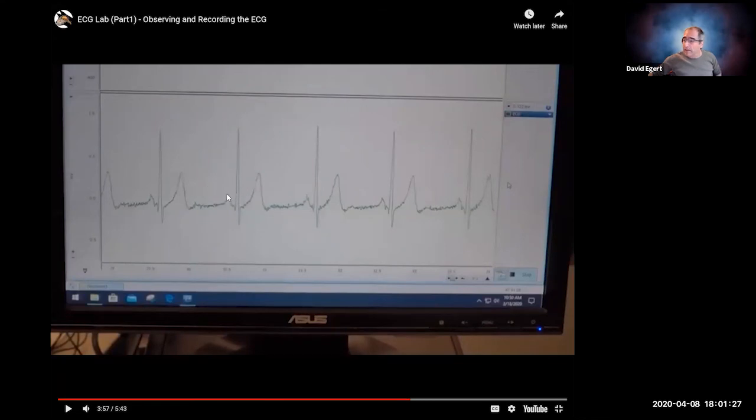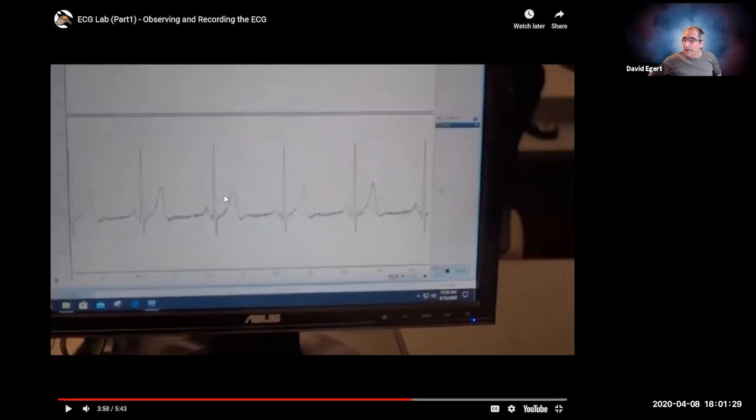All right. So again, QRST. I was trying to do an annotate, but I can't. So there's the P, the QRS, the T. It's very pretty. The next part of the lab, what does it have her do for the next part of the lab? I don't know if you've got the lab manual in front of you. What does it say to do next?